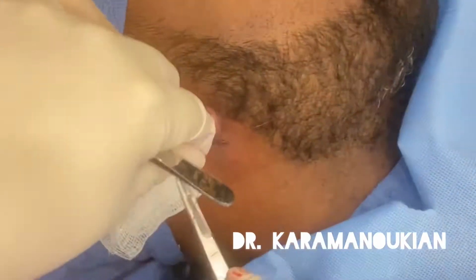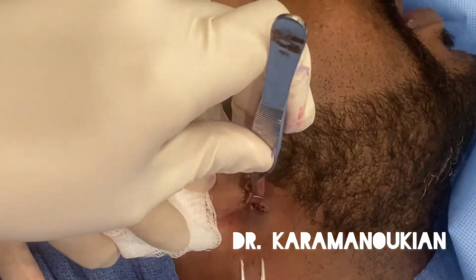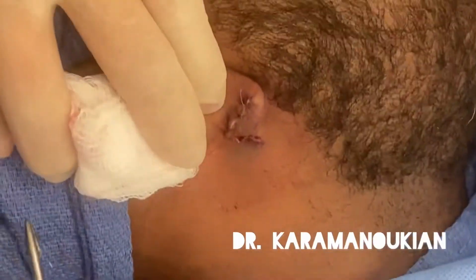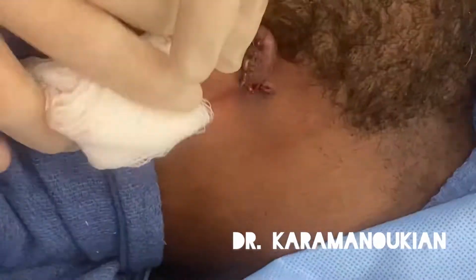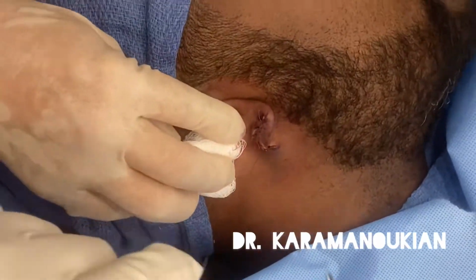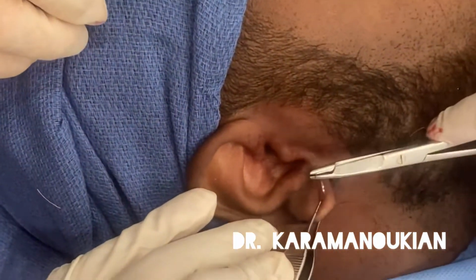The healing process is about 2 to 3 weeks, where we have to make sure that the wound is kept clean and there's no extra tension on the wound. These are the final interrupted sutures. And the surgery is a complete success.